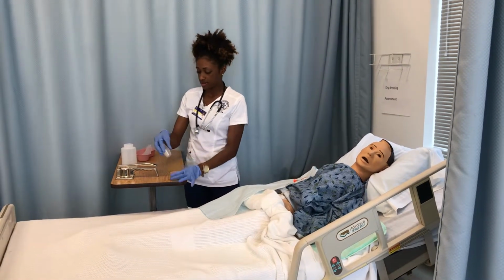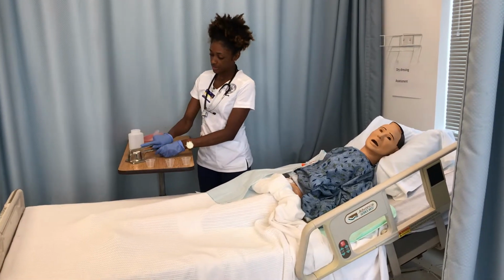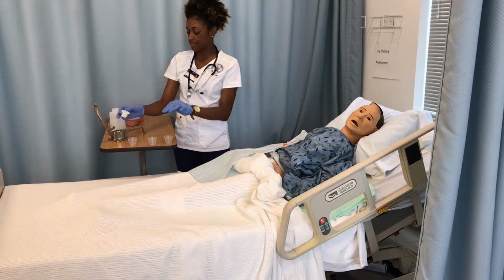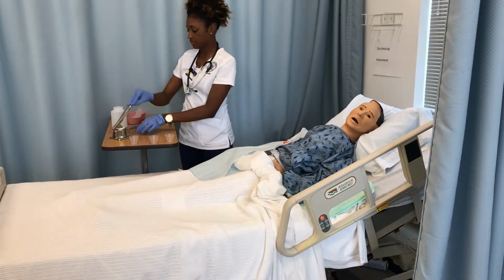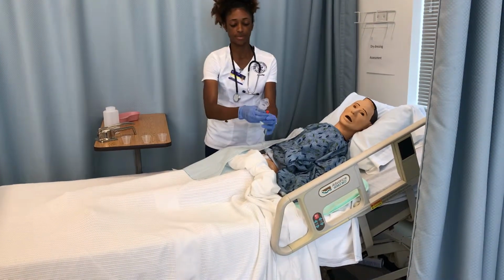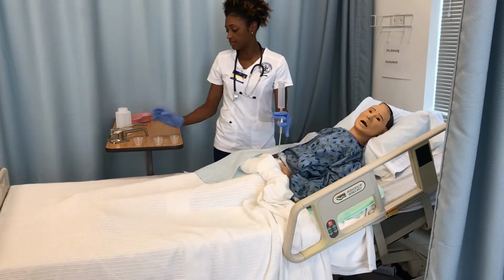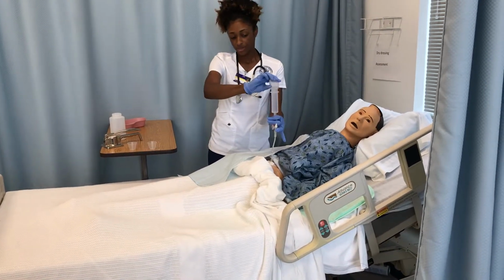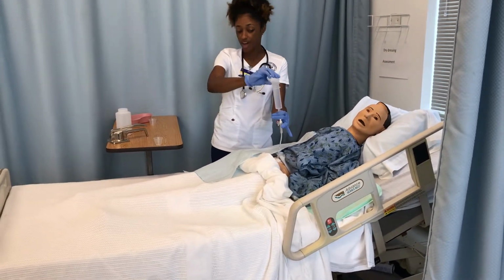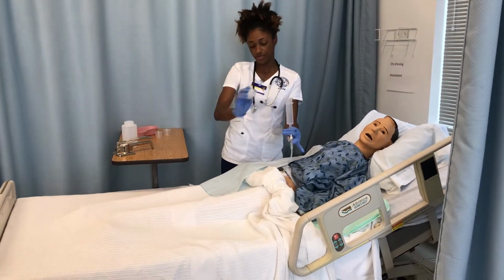Okay, and then I would fill these with 30 cc's of water, and then this one with 5. Crush my medication, and put my medication in the cup with 5 cc's of water. And then begin to administer the medication. So I insert the syringe, open the valve, start with 30 milliliters of water, and then I would administer the medication with 5 milliliters of water and flush that with another 30 milliliters of water.